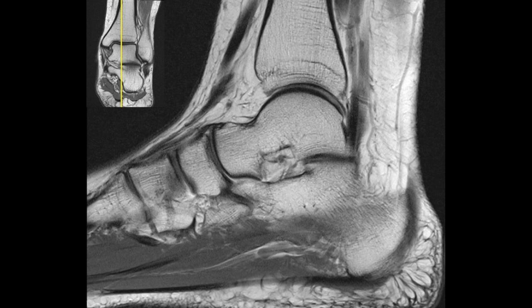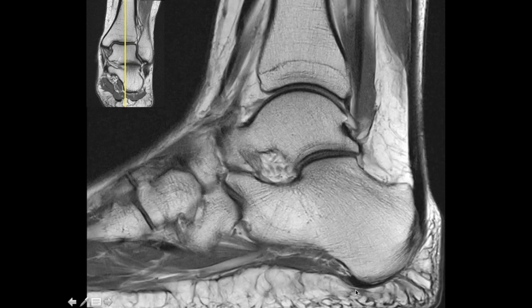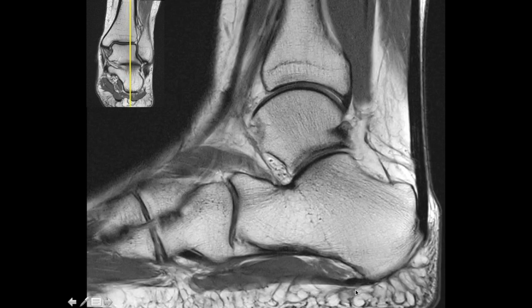The plantar fascia consists of three bands: medial, central, and lateral. The medial band is smaller. This thick band is the central band. Going further laterally, you see another band attaching to the calcaneum which is thinner than the central band — this is the lateral band of the plantar fascia.